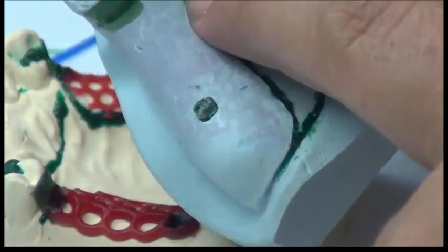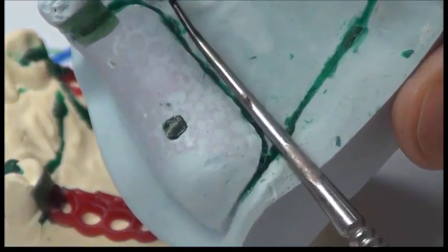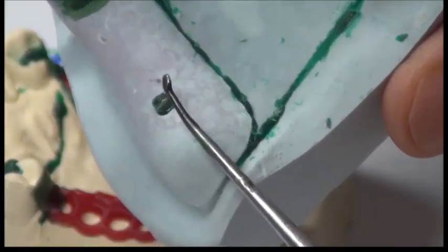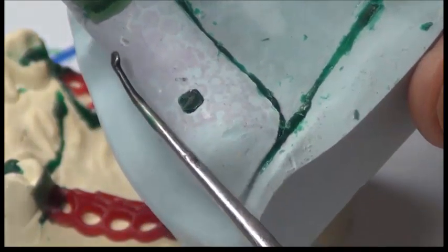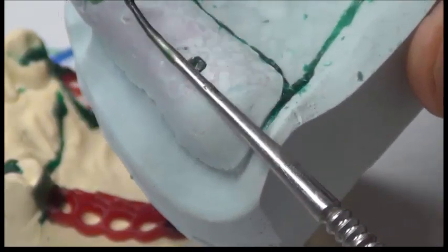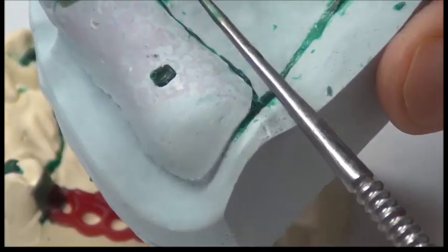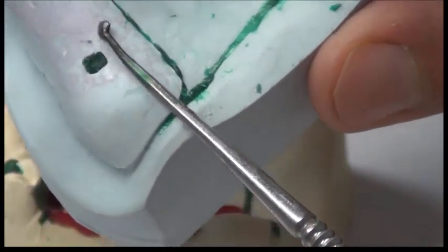When we placed the relief wax, we placed the wax over the ridge, overlapping the ridge and going more palatal, away from the marginal gingiva of the new teeth. Remember that I'm going to add new teeth here. I'm going to add a tooth here, a tooth here, a tooth here. The new teeth will have what we call the marginal gingiva, the same morphology of the marginal gingiva. So the first layer we added with the relief, we extended it like 4, 5, 6 millimeters beyond the marginal gingiva, where it's supposed to be.